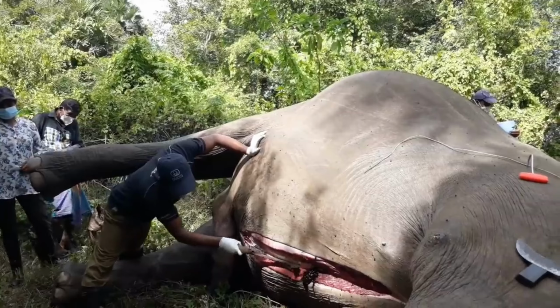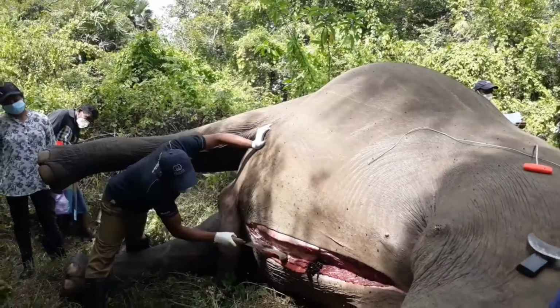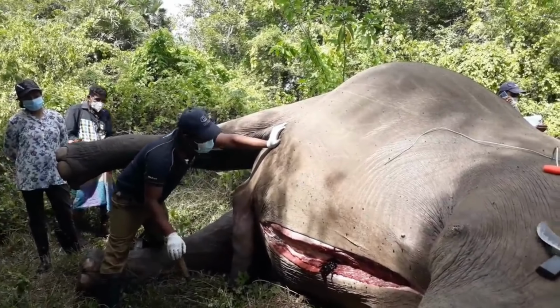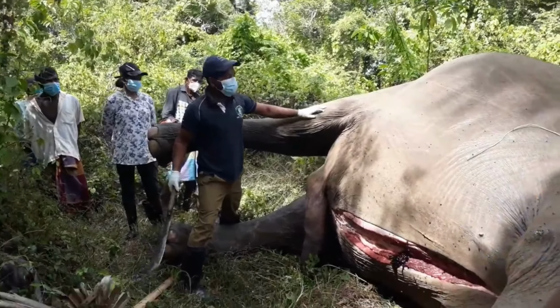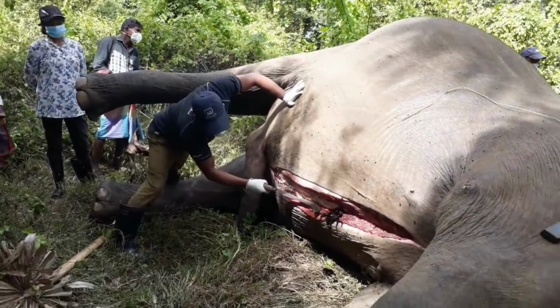Moving forward, as we explore the rest of the abdominal cavity, there are no other abnormalities to note. The significant internal bleeding caused by the ruptured vessel appears to be the sole issue. This kind of hemorrhage can be sudden and unpredictable, making it a tragic but valuable case for us to study.